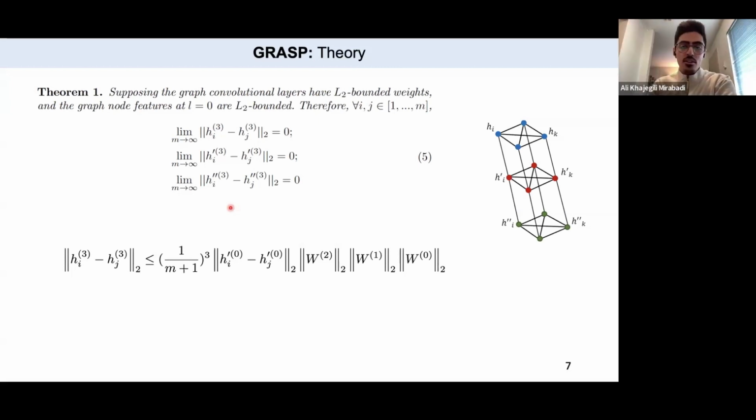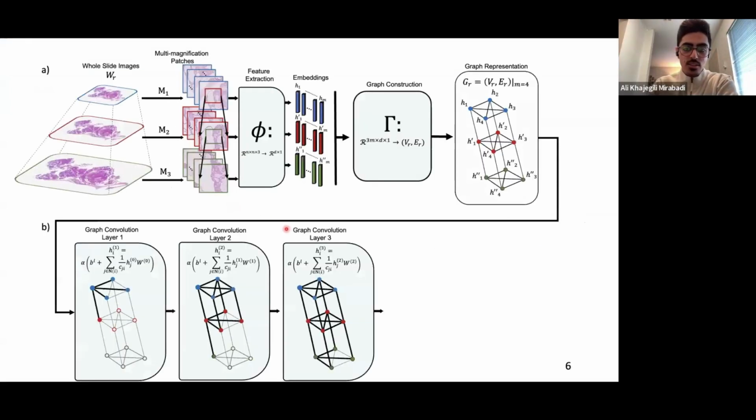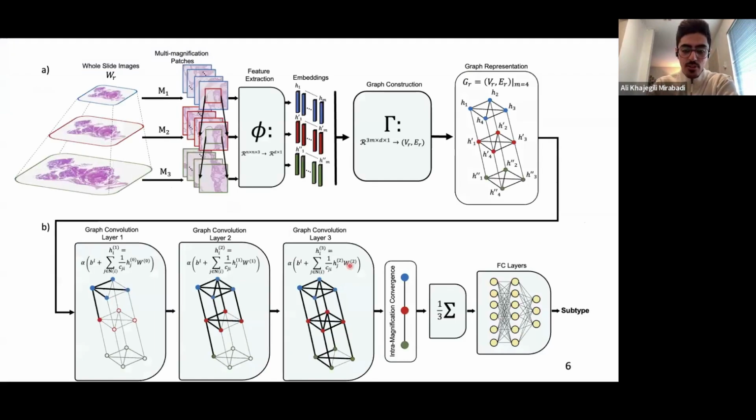So I think your question is for this part, why the convergence matters, right? Yeah. Okay, so we have this convergence in other models as well, but we call it pooling. They do a lot of operations and at the end they pool.